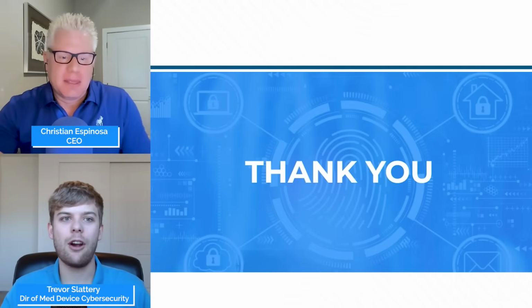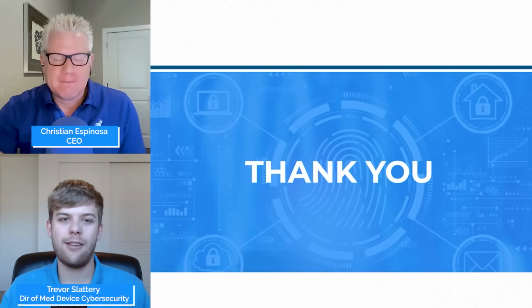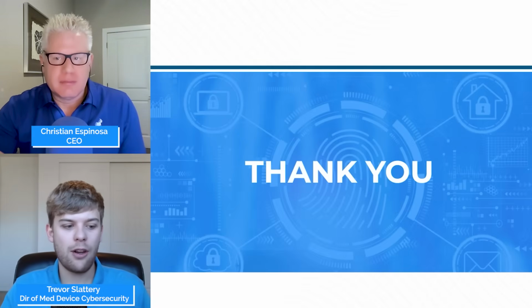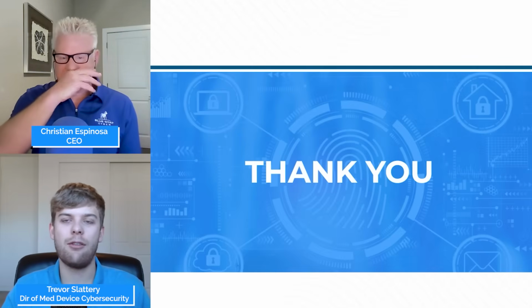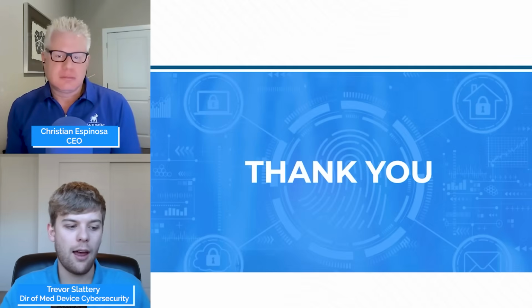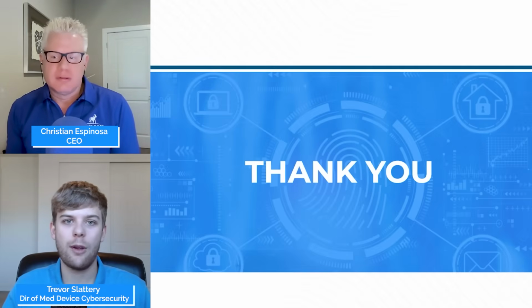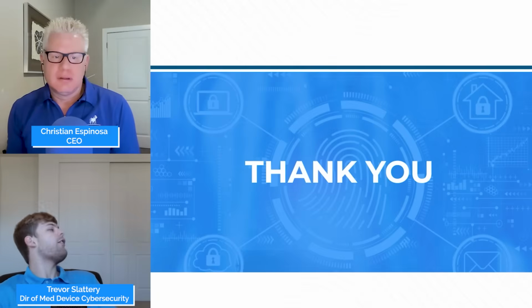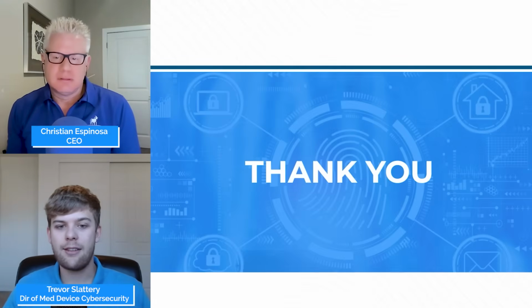Part of the FDA requirements are proving the tester's expertise. So talking about how many years of experience the tester has, certifications are obviously a great way to do that. As far as what I recommend, there aren't too many great certifications out there for Internet of Things testing. There are a lot of courses available. I know the Cyber Mentor has a great course on Internet of Things testing. And there are a lot of different resources available just on the internet to try to get into it. There's a book, which I have over there, called Practical IoT Hacking. That's really good for brushing up on this side of things.